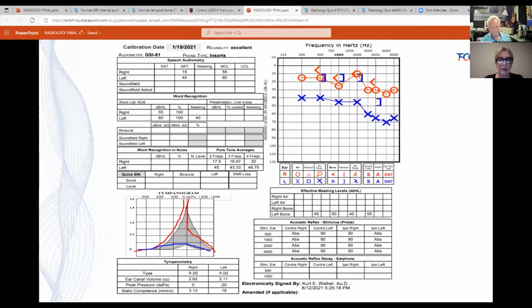And the left ear, the tracing, you can see instead of the tracing coming to a peak, almost like a triangle in that red tracing that you see with the right ear, the left ear is very, very close to the bottom. There doesn't appear to be a lot of movement at all. The movement is very shallow. So that is indicative of potentially an eardrum related, middle ear related issue. And that correlates with the hearing test where we see that you have that gap in response between air conduction and bone conduction. So it's adding support to the obstruction, that there's something obstructing sound from getting through.